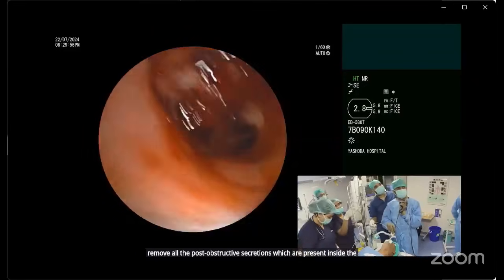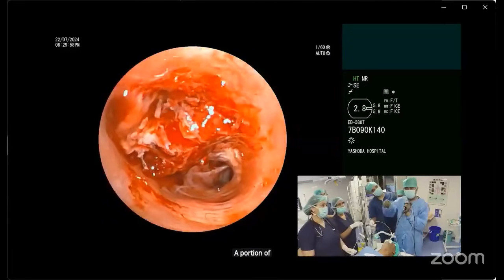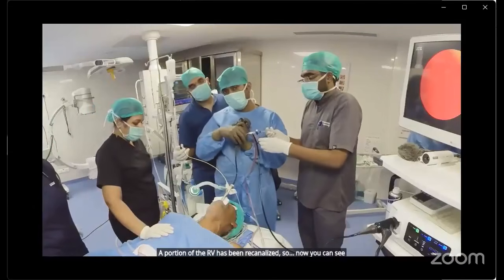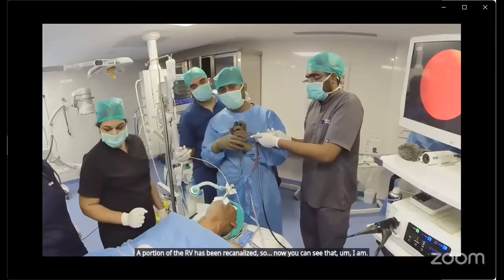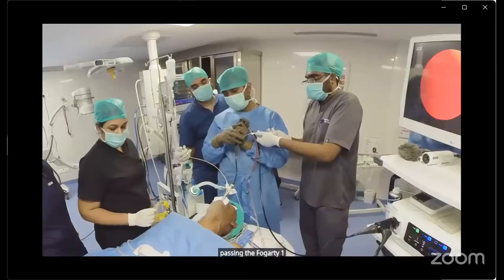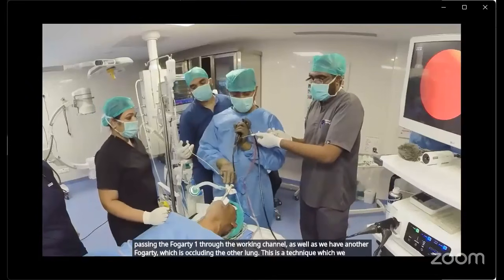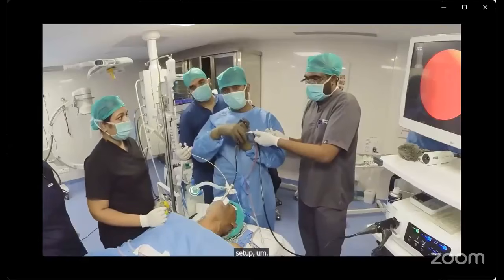Now you can see that a portion of the airway has been recanalized. So now you can see that I am passing the Fogarty one through the working channel, as well as we have another Fogarty which is occluding the other lung. This is a technique which we follow in our setup. That is not something universal.